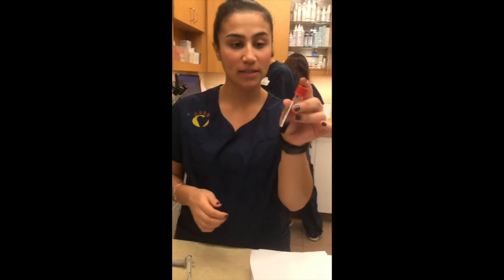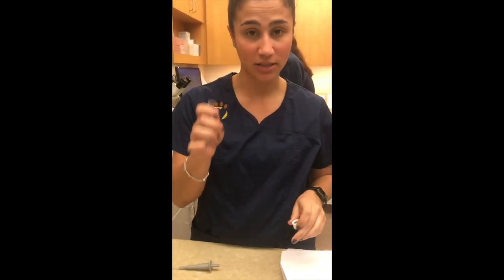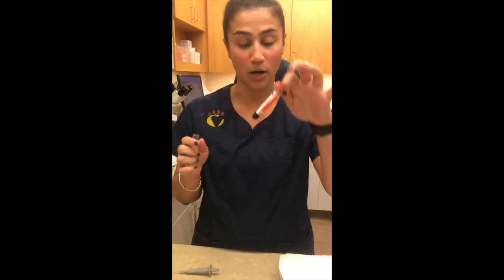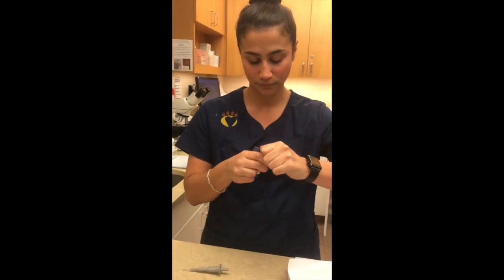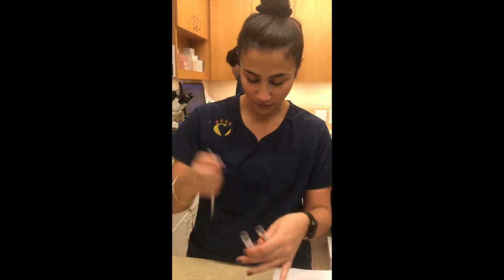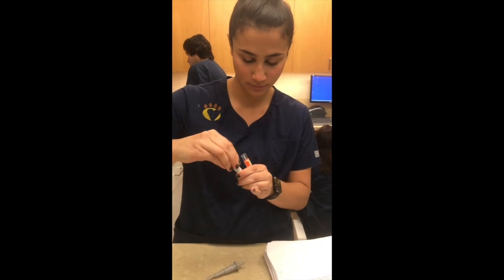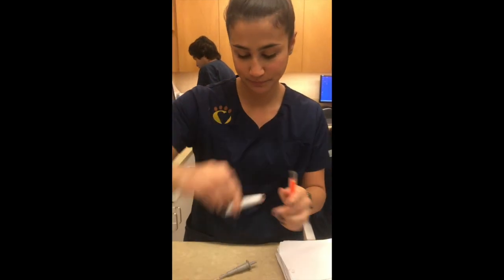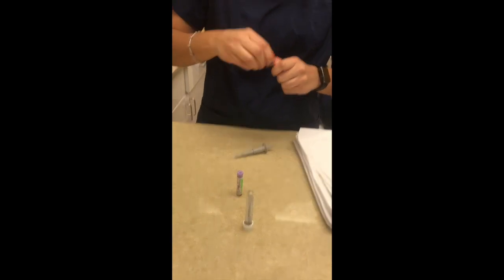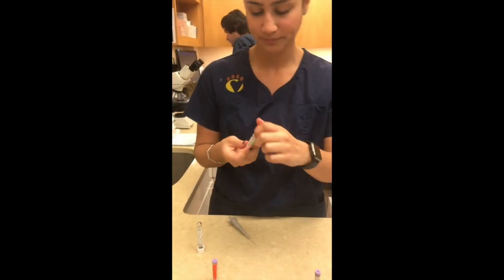I spun down our serum in our serum separator tube, and now I have a plain tube with no additives at all. So now I'm going to open this and add our serum into the plain tube. First I'm going to do our donor blood, using a pipette. Perfect. And now we have our donor serum. And do the same for our recipient serum.